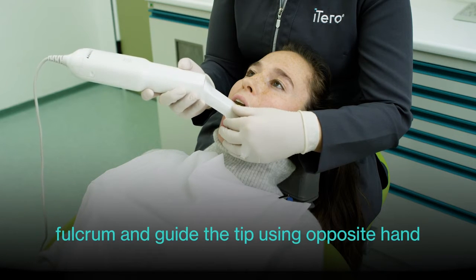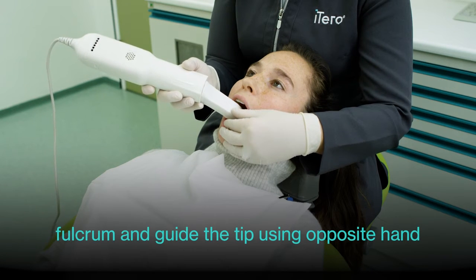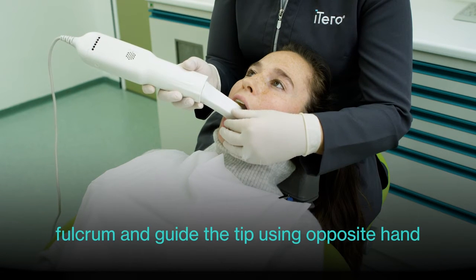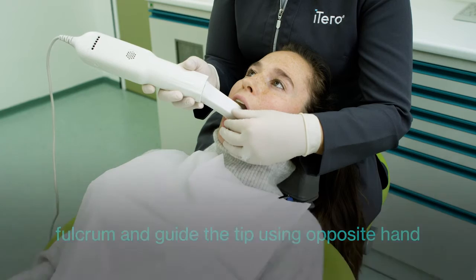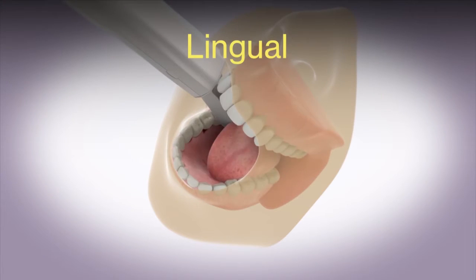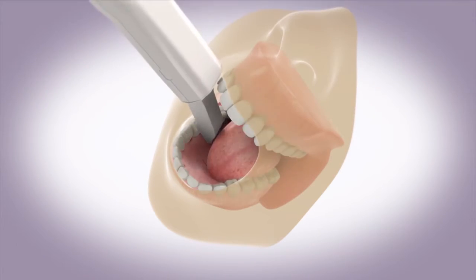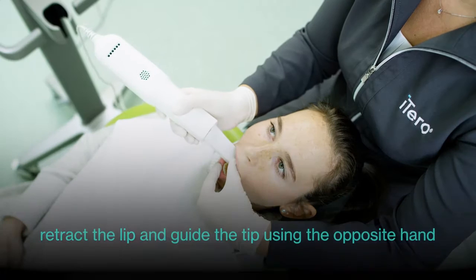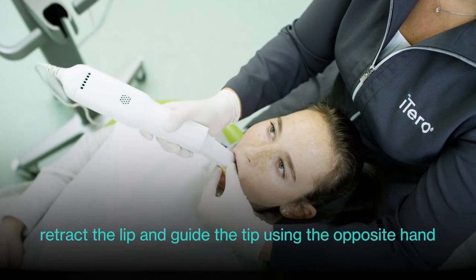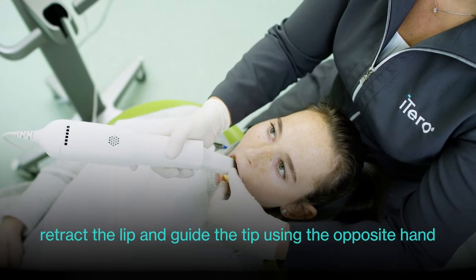Once you have reached the terminal tooth, rotate to the lingual. Bring the cable end of the wand out to the side and maintain a 45-degree angle of the wand tip to the lingual surface.